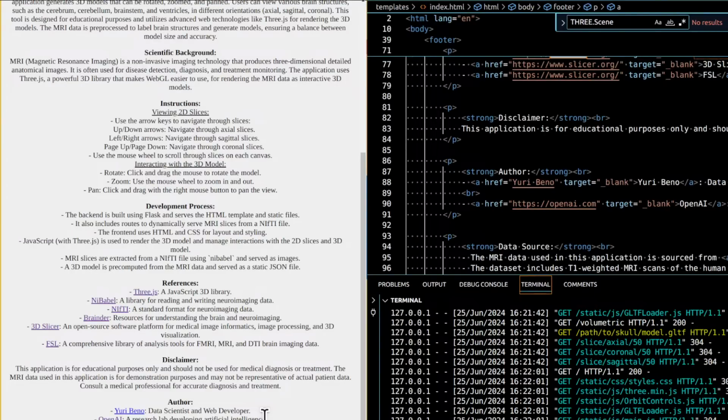Example workflow with BrainDir. 1. Pre-process MRI data with BrainDir. Run BrainDir. Use BrainDir's command line tools to pre-process the MRI data. Example command, bash: BrainDir input sub-01_ss1_t1w.nii output_directory. To verify the output, ensure the output includes the skull-stripped brain and any other required files.